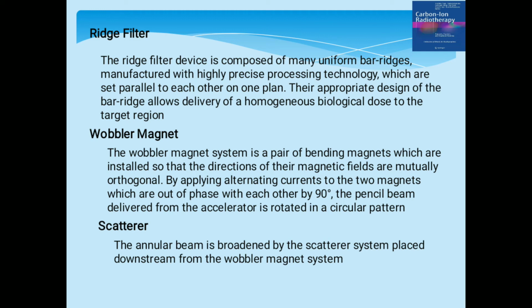Ridge filter. The ridge filter device is composed of many uniform bar ridges manufactured with highly precise processing technology, which are set parallel to each other on one plane. The appropriate design of the bar ridge allows delivery of a homogeneous biological dose to the target region.